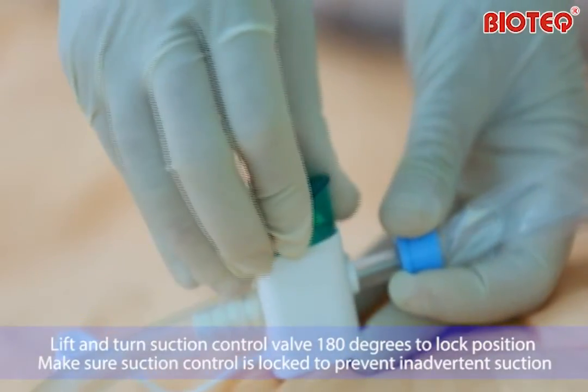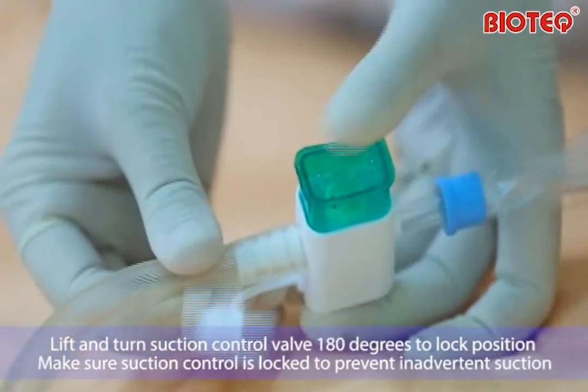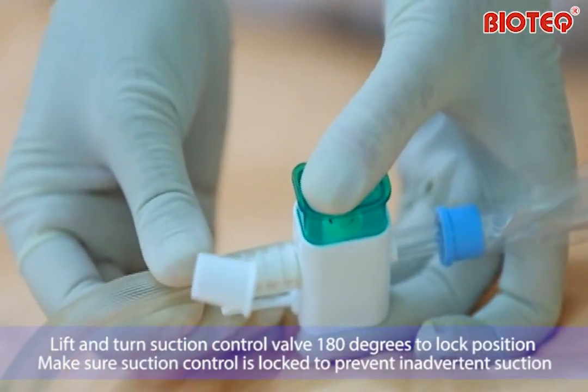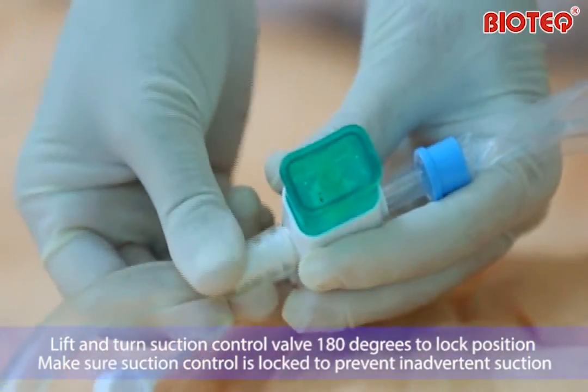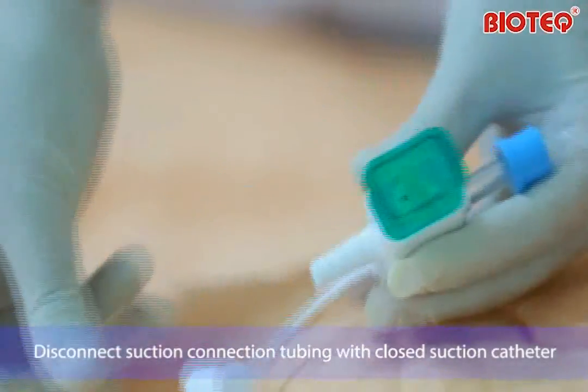Lift and turn the suction control valve 180 degrees to the lock position. Make sure the suction control is locked to prevent inadvertent suction. Disconnect suction connection tubing with the closed suction catheter.